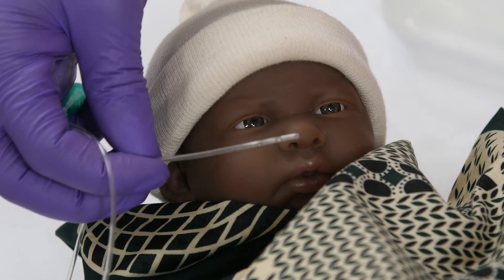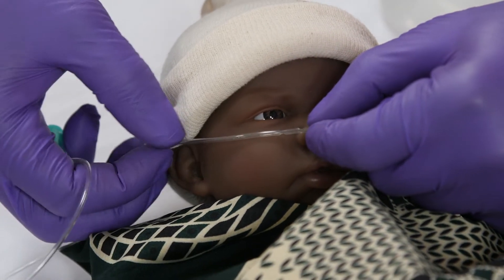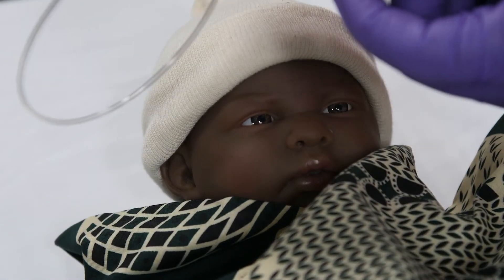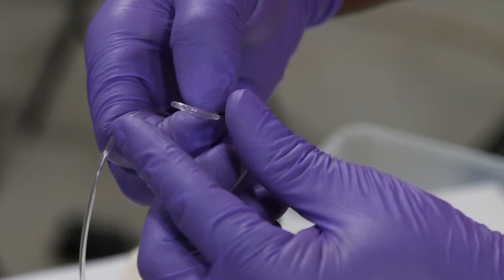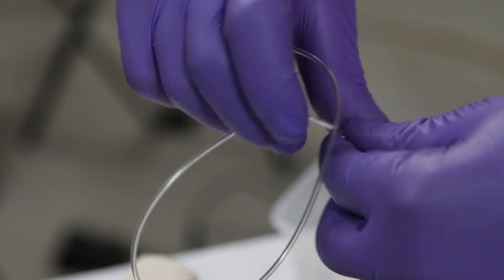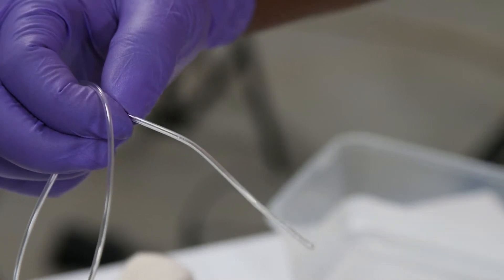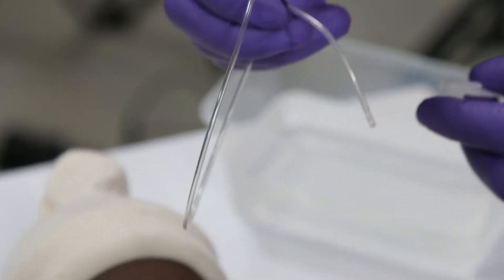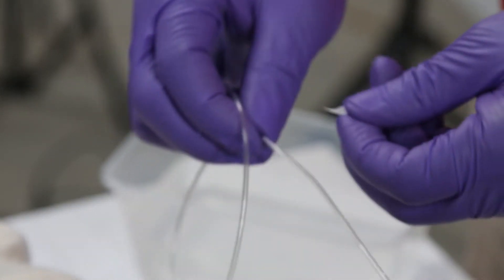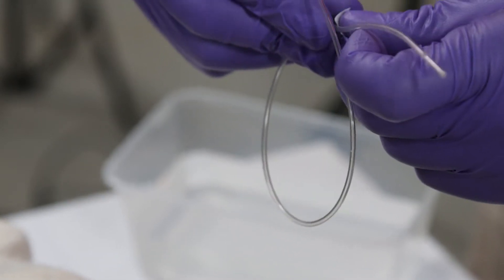You need to mark the depth to which you will suction, so get a small piece of tape ready to mark with. Measure from the tip of the nose to the ear lobe and halfway back. Fold it in half and then add the extra half length. Make sure you do not make it longer, otherwise you will suction too deep which can cause vomiting and other complications. Mark the measured distance on the catheter with the tape.